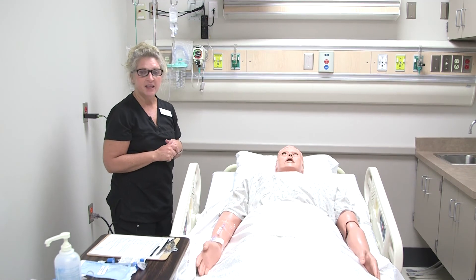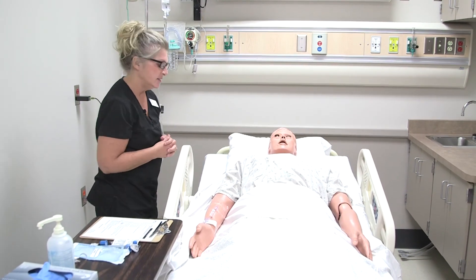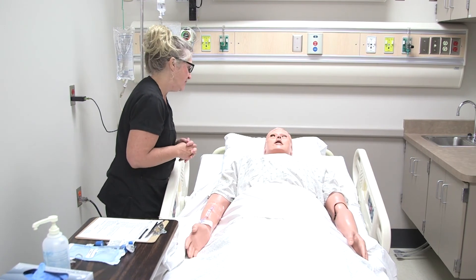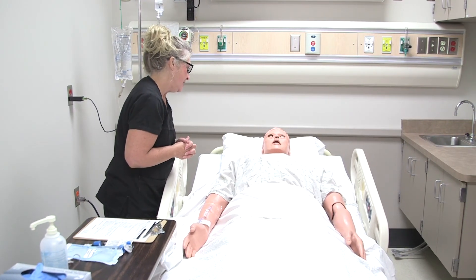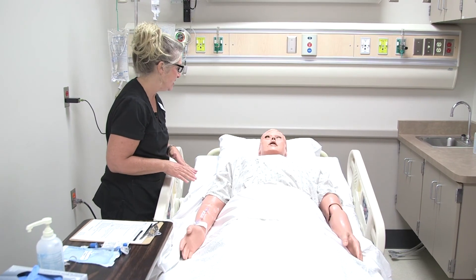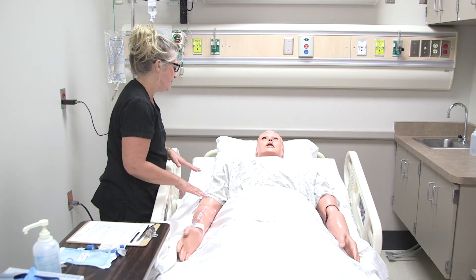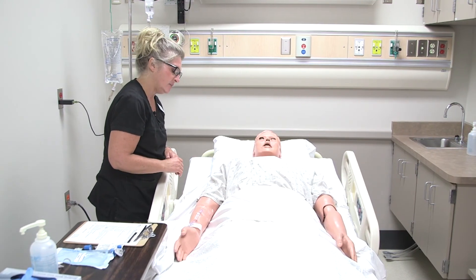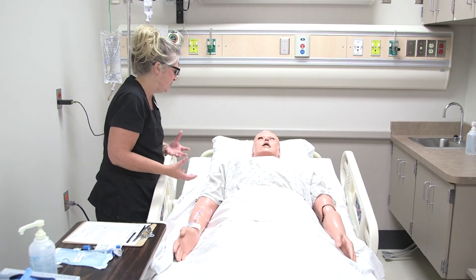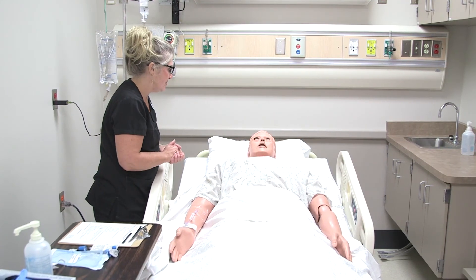We're going to come back in about 15 minutes and check on the patient and the IV site. All right, how are you doing, Tim? We got everything going here. Great. Once again, I'm going to make sure that I come back and check on you, but before that time, let me know if you're having any discomfort at that IV site — any burning, stinging, or if you feel like fluid is leaking out of the site — use your call light and let me know and I'll be right in.